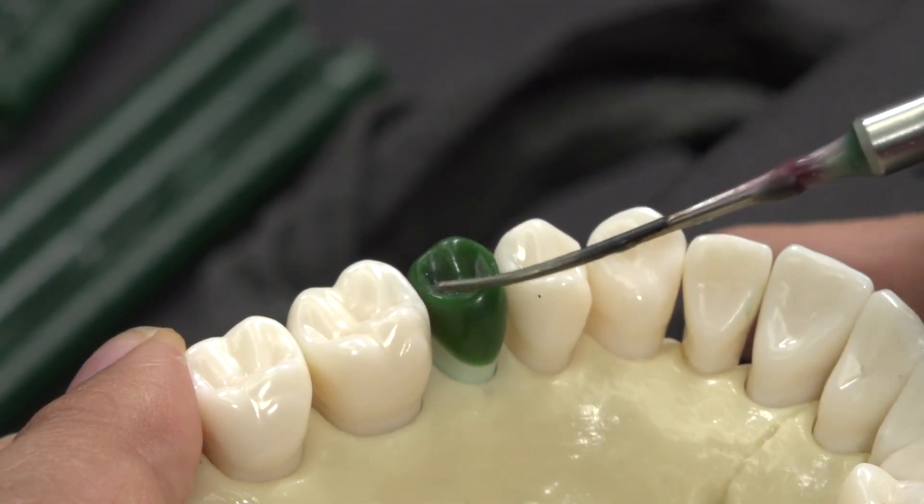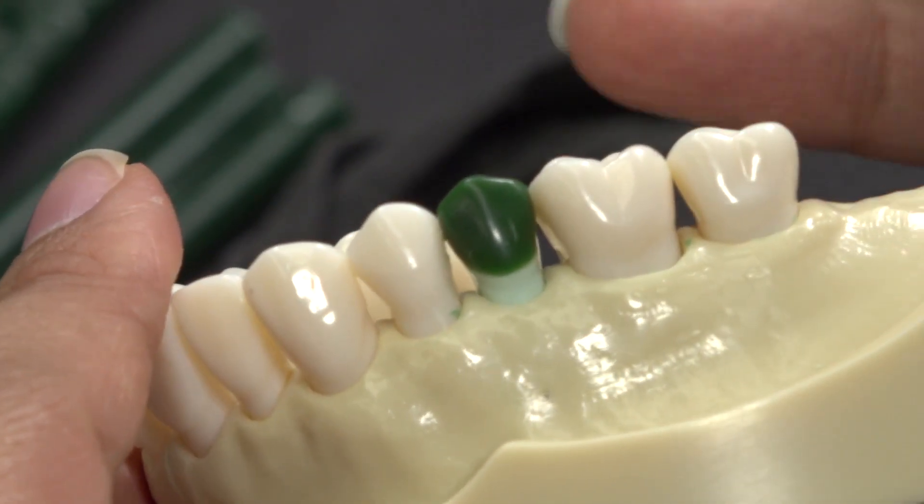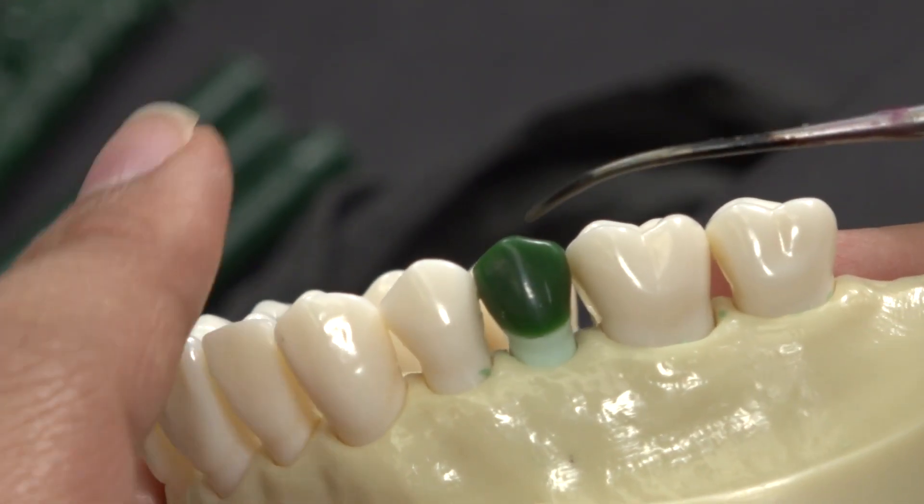Notice how the contact is in the right place, the occlusal is well defined and polished, the cusp tip is defined and in the right place, and notice how defined the diamond shape is.